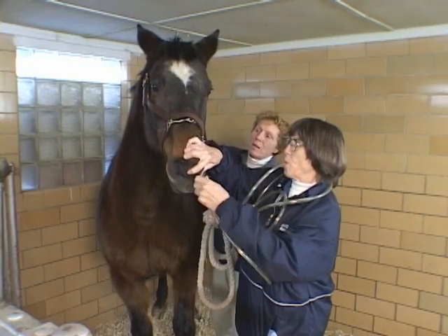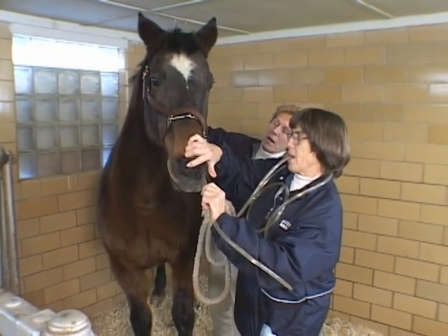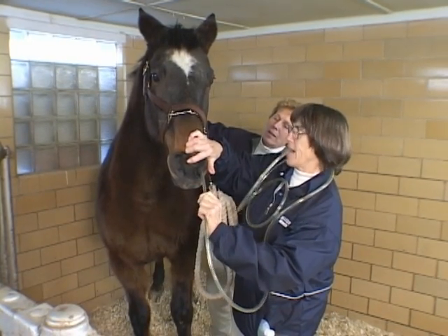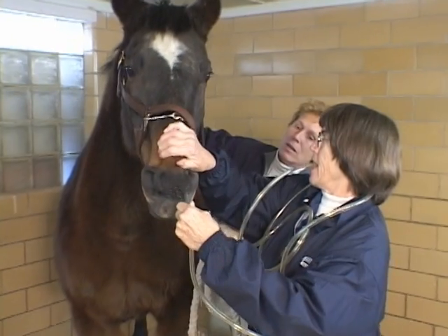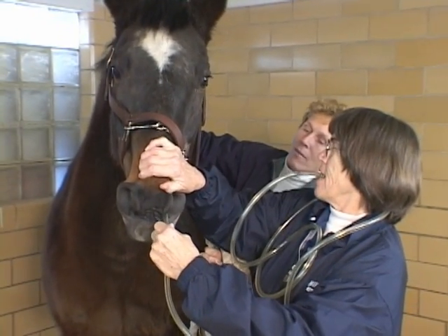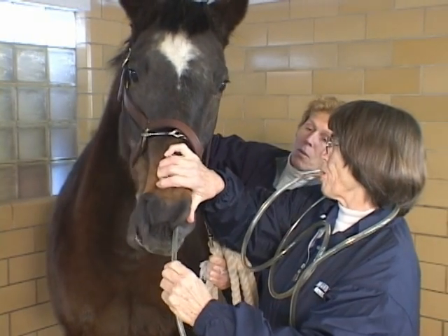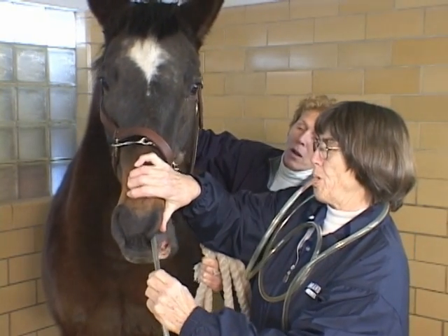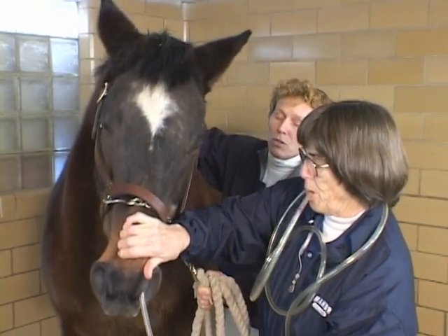Dr. Hamill is all the way back into the pharynx and she's prompting him to swallow a little bit just by manipulating that tube and bumping up against his pharynx. There — I think we've got a swallow just then. Veterinarians have a variety of different ways that they use to tell where they are; it's partly by feel because the esophagus is a potential space.